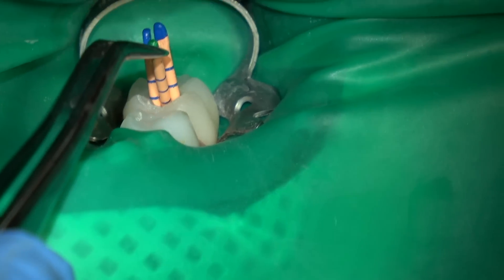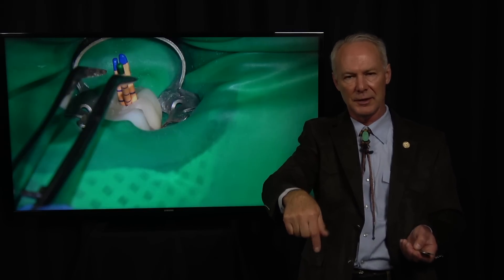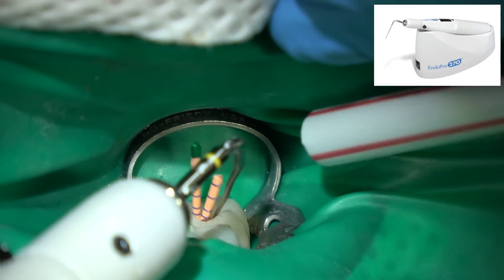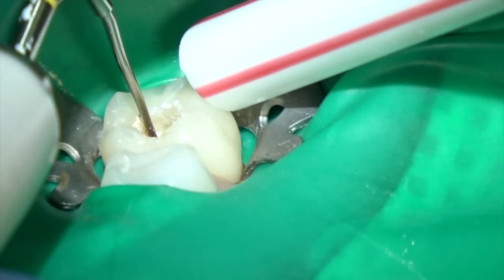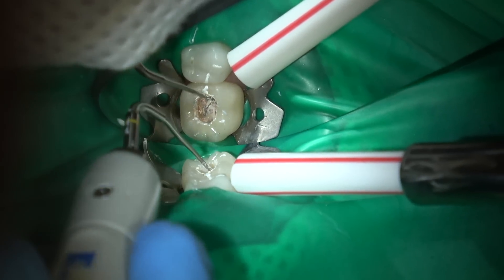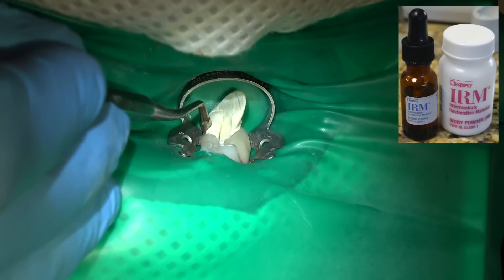Squirt the BC Sealer into all three canals. When you place your gutta-percha cones, place them straight in — don't move them up and down because you don't want to incorporate air bubbles into the sealer. When you place the gutta-percha cone, that's going to push the sealer into any little crevices of the canal — straight in. Then sear them off with the Endopro 270 heating element, go down into the canals just a little bit to soften the gutta-percha material, then come back with a small plugger and just press them into the canal.